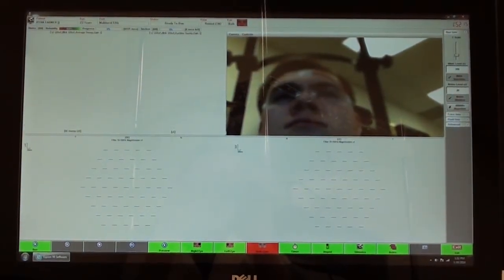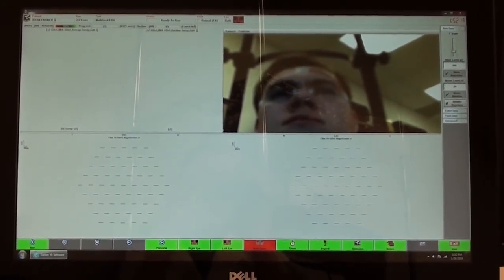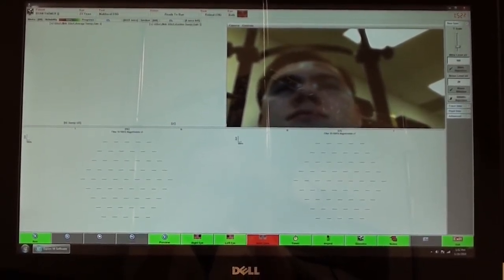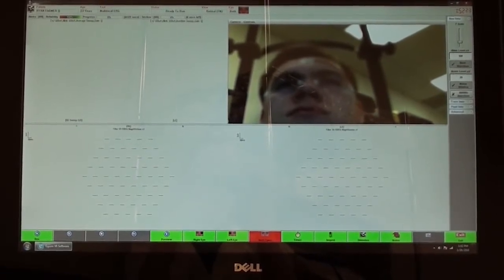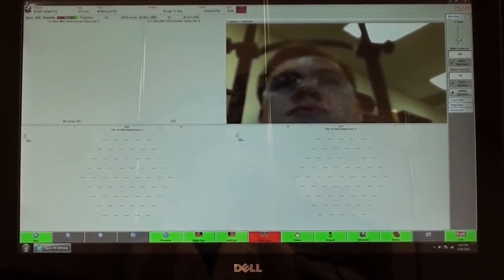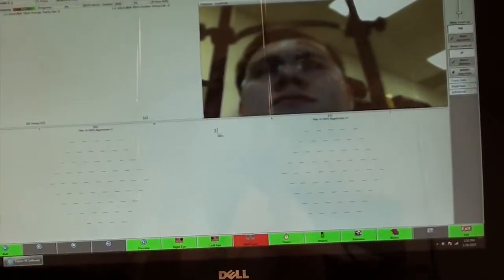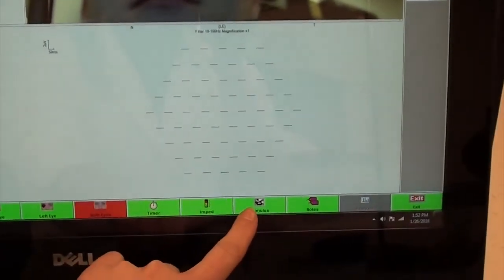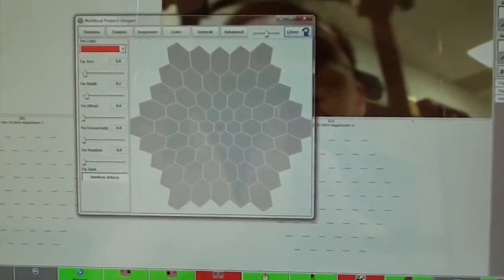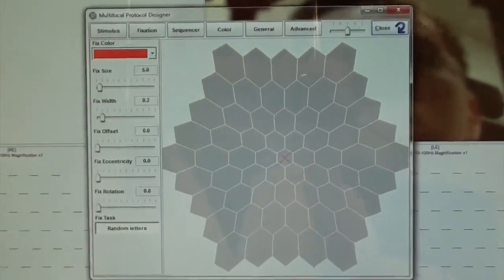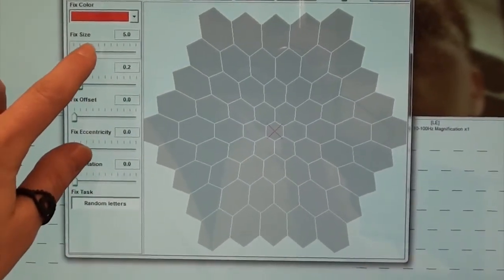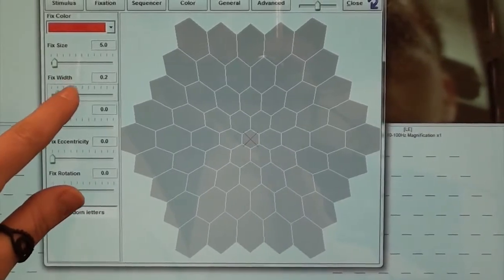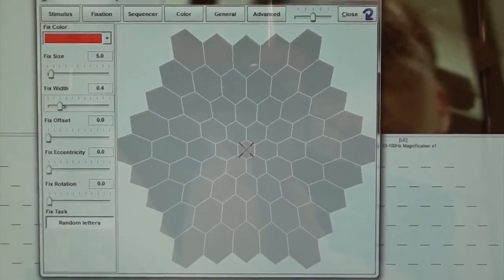Once the patient is comfortably seated in front of the monitor, we make sure that they can see the red fixation mark in the center of the screen. If the patient cannot see the red fixation mark, we can enlarge it by clicking stimulus and changing the size and width of the X.